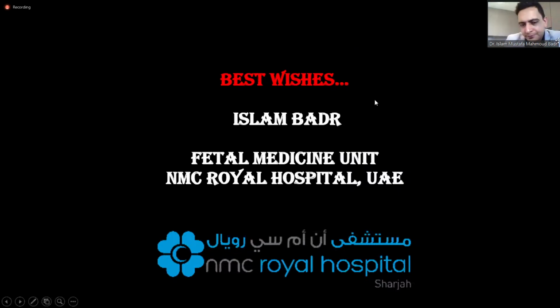Three take-home messages? Okay. Yes, sir. The first message is that examination of the fetal heart is extremely important. In fact, we do that routinely in the mid-trimester scan. When the patient comes to do her second trimester scan, usually between 18 and 23 or 24 weeks, we do what we call the fetal cardiac screen, getting some basic views like the one I have shown in my presentation. This should be done for every pregnant woman, whether she is a high-risk or low-risk patient.